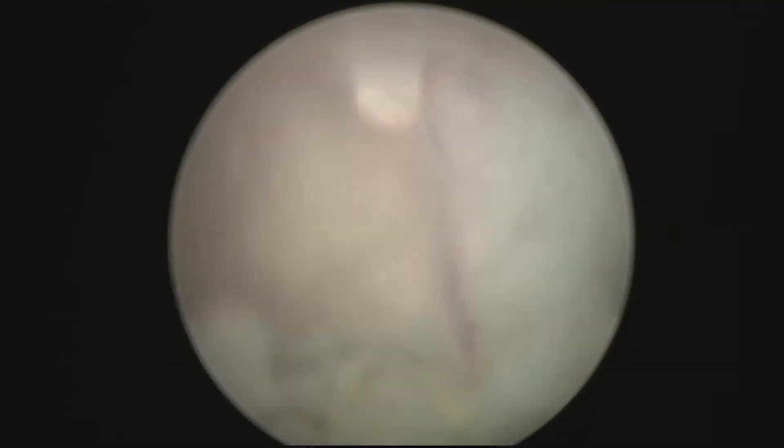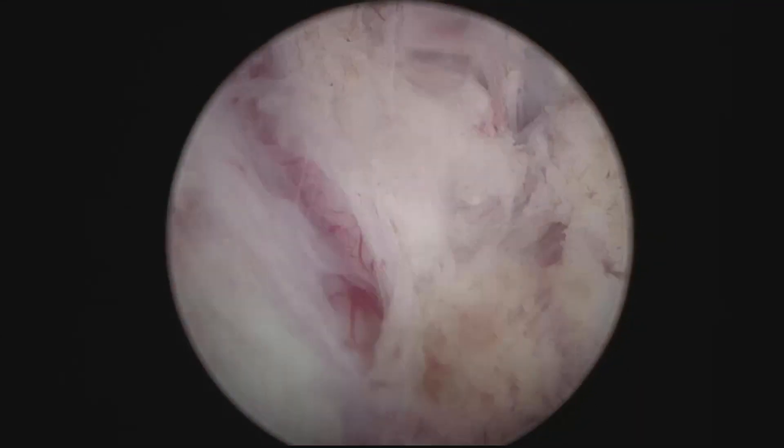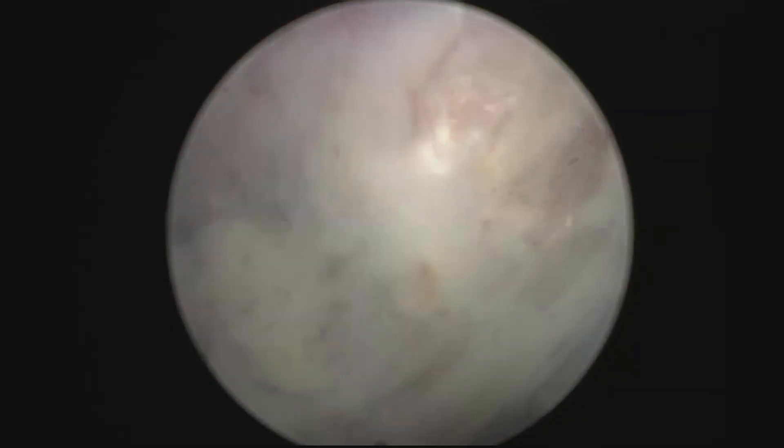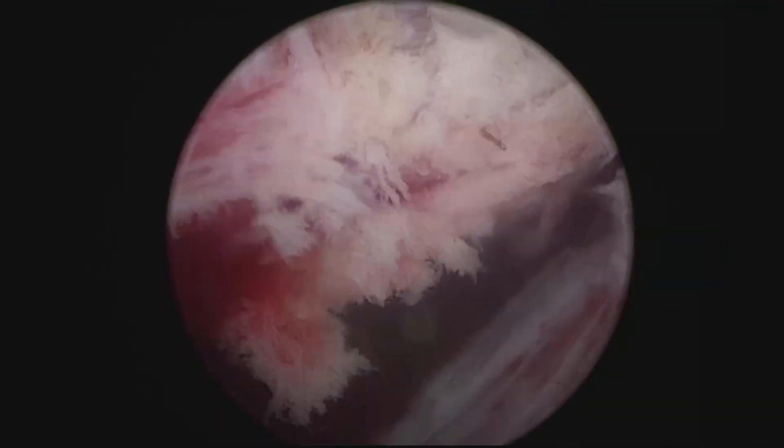What I'm doing is cutting into the prostate first, just three or four millimeters in depth. You can see now that the prostate detaches from the sphincter a little bit. This would be a wrong plane, but I'm not concerned about this now because I will go to look for the good plane. Once I have cut four or five millimeters into the prostate following the white line, keeping the fiber horizontal at the 12 o'clock area, what I have done is I have detached the sphincter from the apex. You have to follow this curve that we marked initially, bring it up slowly, don't hesitate to cut a little bit into the adenoma. That's the mucosal edge at 12 o'clock.